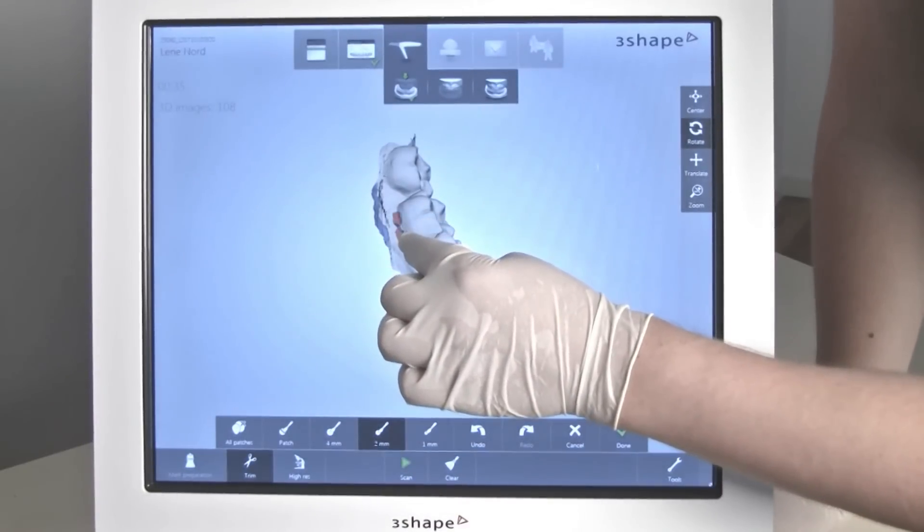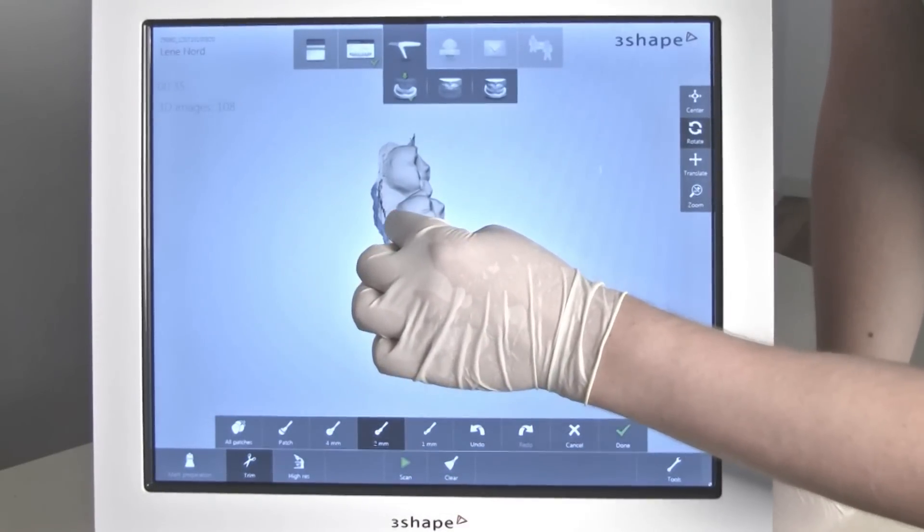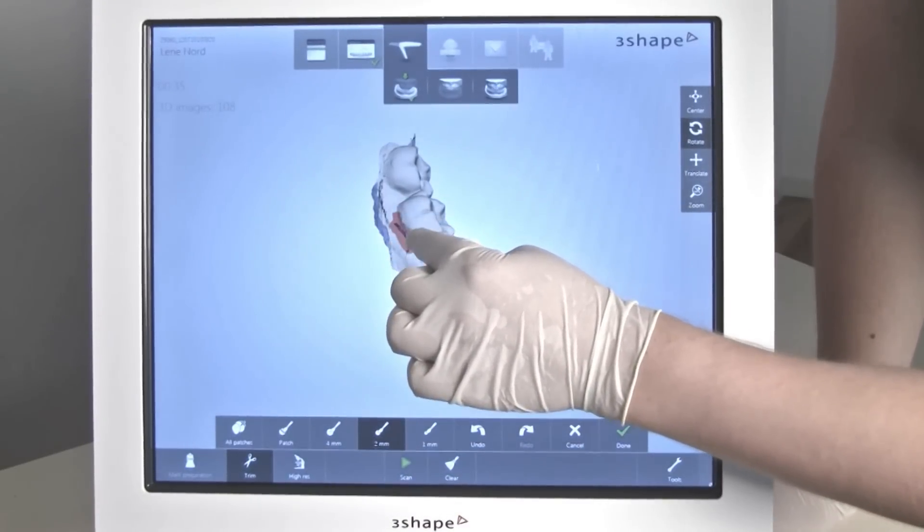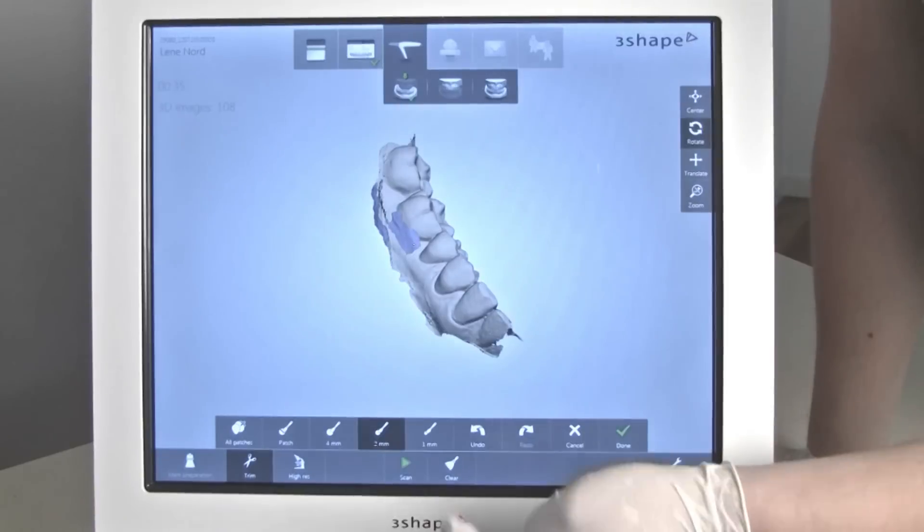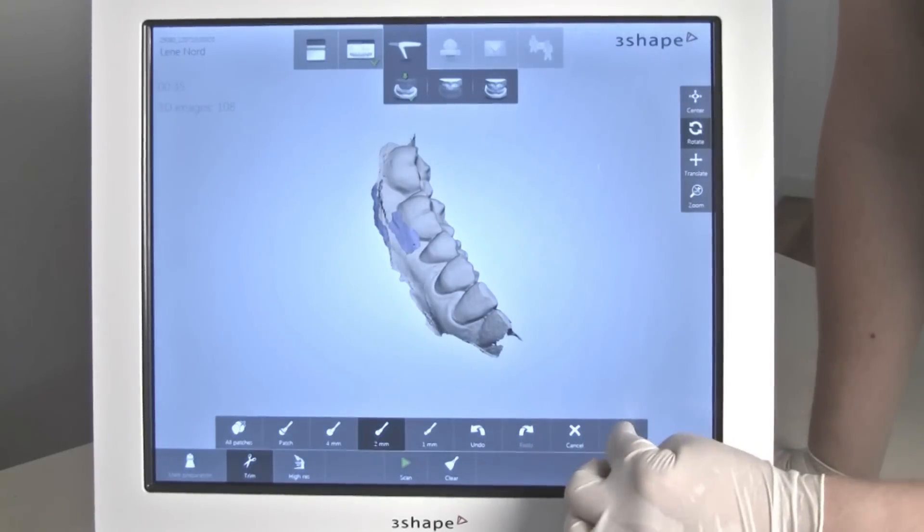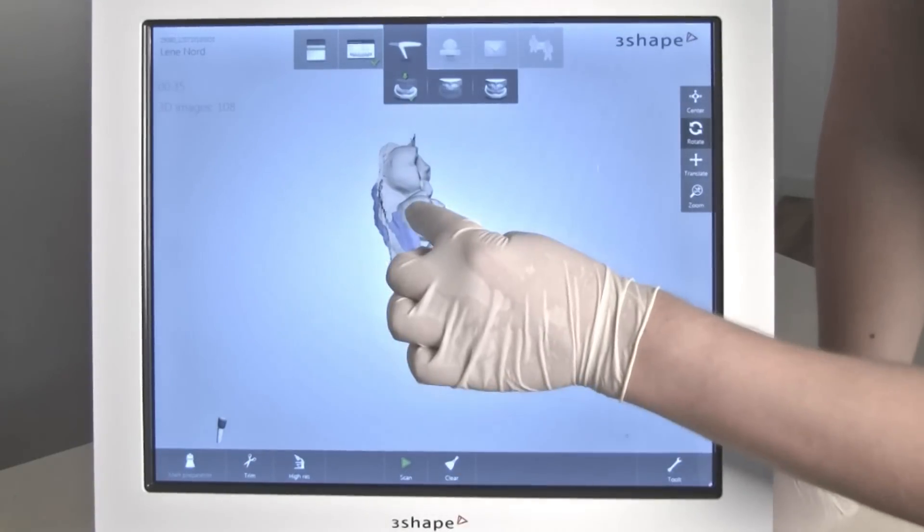If you wish to redo specific areas, simply delete those on the screen with your finger and re-scan.